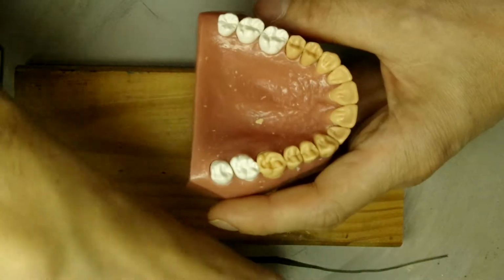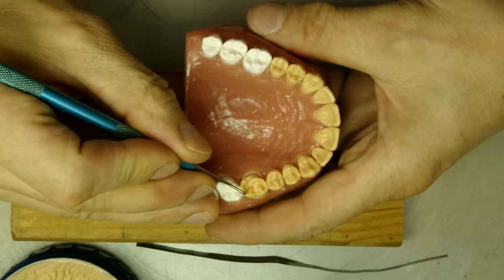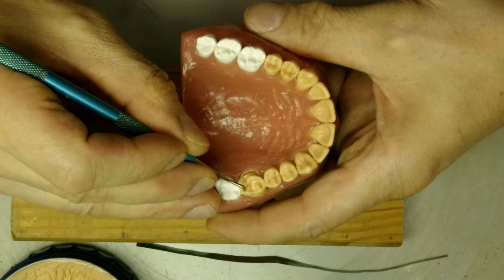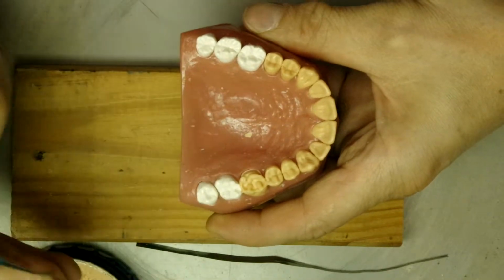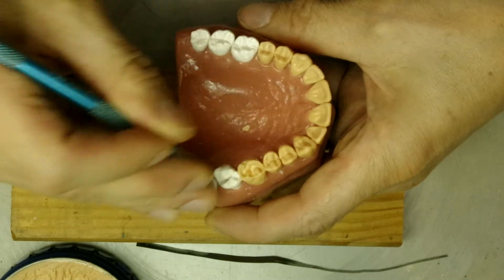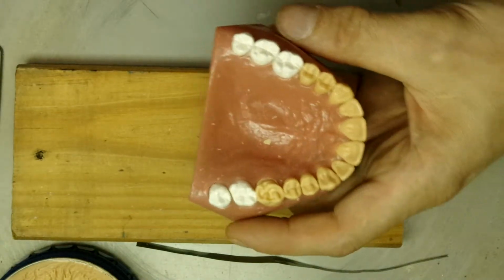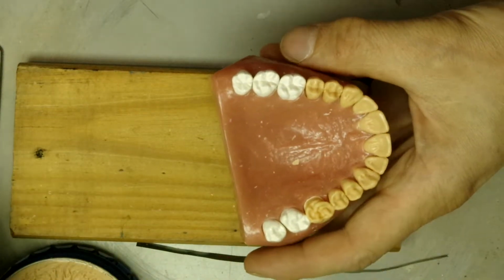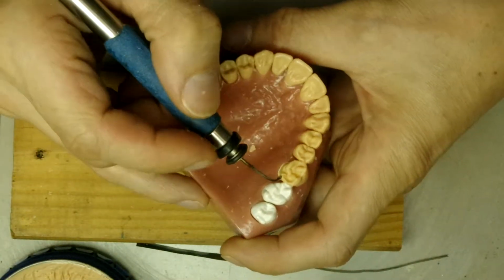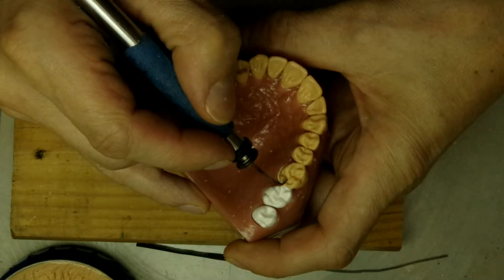Alright, let's make a little bit more room here. This way maybe we can put a little secondary ridge there. Can make a little tiny triangular ridge right here.